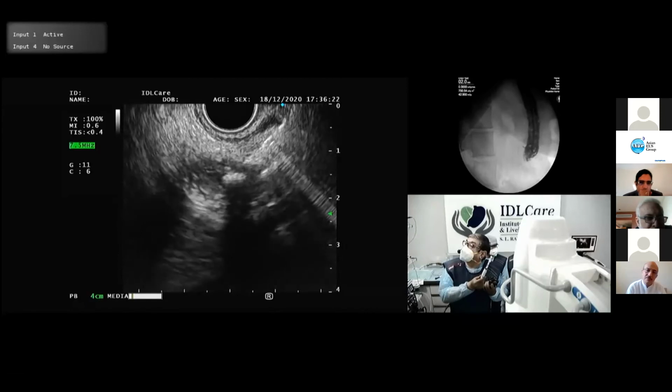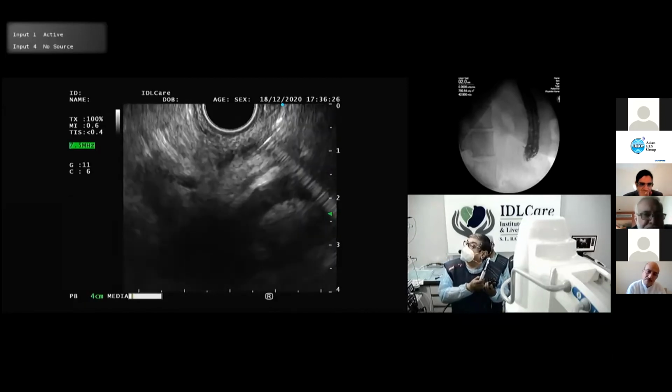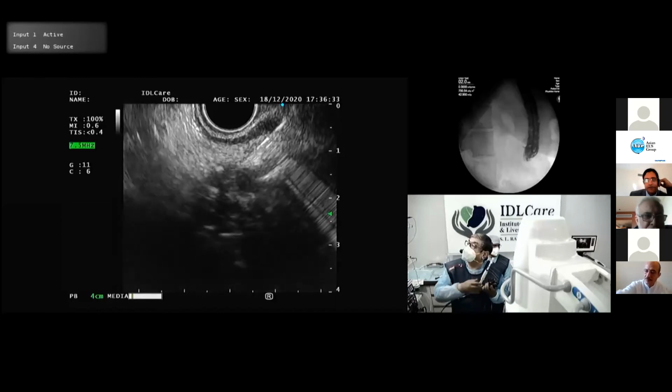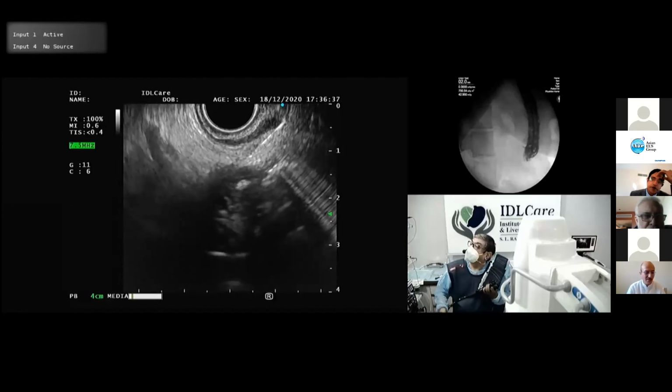I am only in the wall here. Yogesh? Yeah. I think we should give up. I've tried enough, I think. I'll probably try ERCP once again, plus or minus Spyglass, maybe another option.